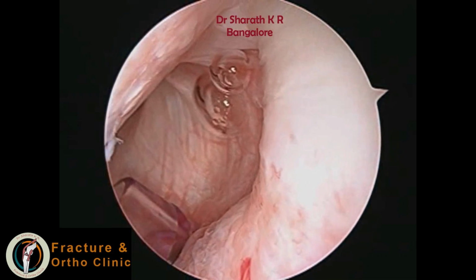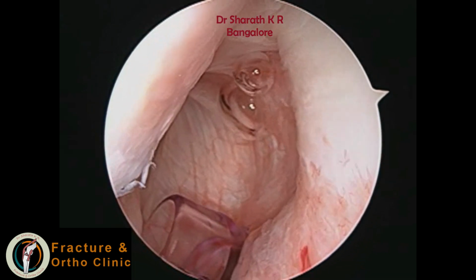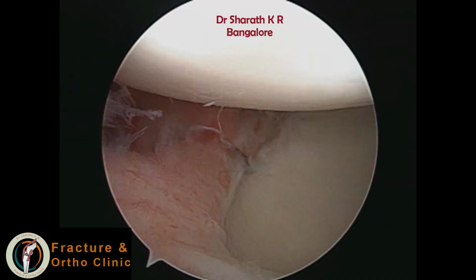You can see that the joint is nice and the labrum is nicely fixed all round.